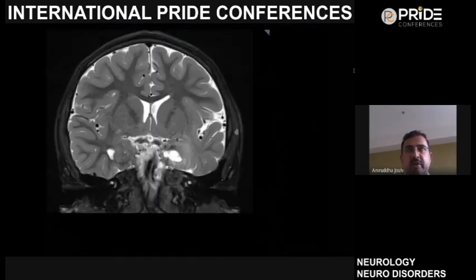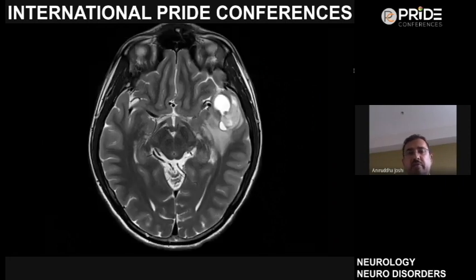So coming to the tumors, a few tumors we had seen in case of temporal lobe involvement, mainly the bubbly appearance of these cystic lesions seen in the left hippocampus. These are the DNET. These are completely removed area of interest, and the seizure outcome is good in these kind of patients.